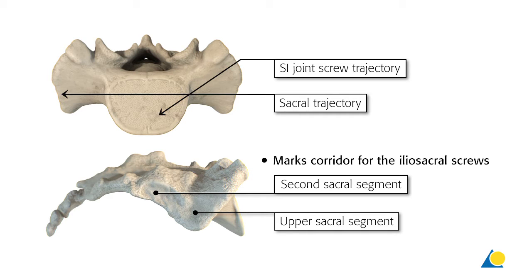The second sacral pathway is consistently located cranial to the nerve roots exit at the anterior neuroforamen and on the inlet image just posterior to the anterior cortical limit. On the lateral image, the caudal anterior pathway is best seen.